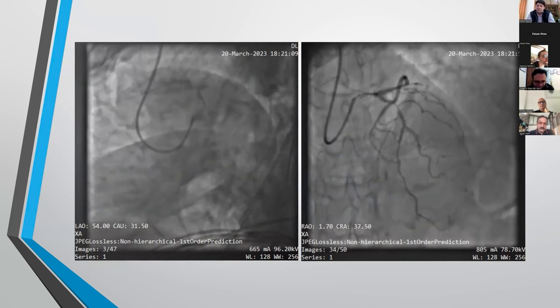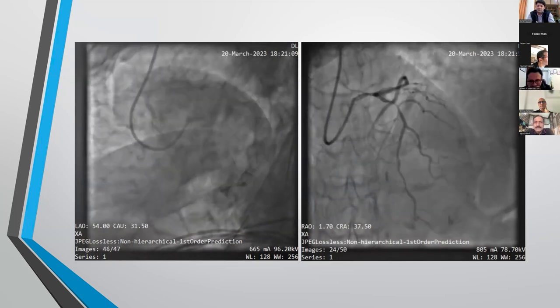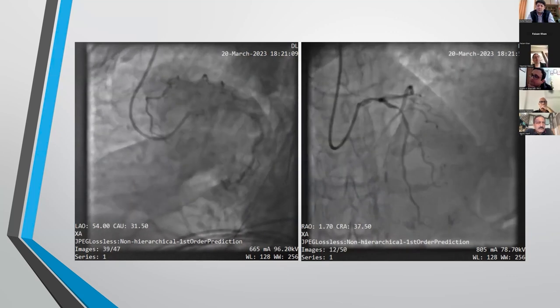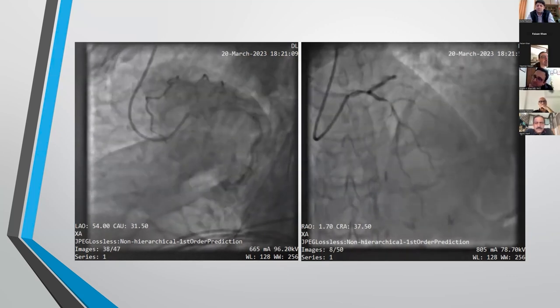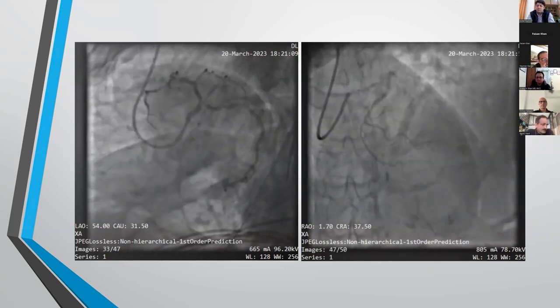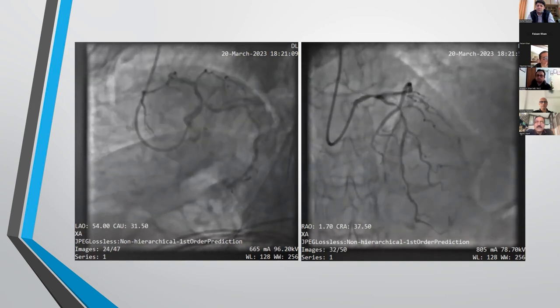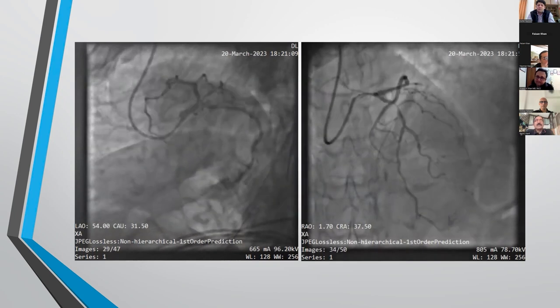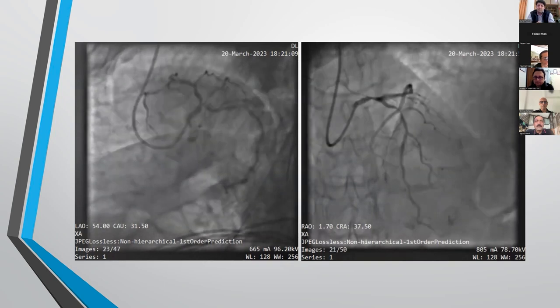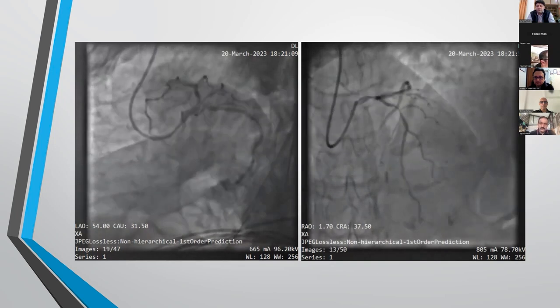It's very educative. The only point I'd like to add here is that for left main stem, we can do an FFR and then we can talk about the significance of, let's say, circumflex ostium and all. But in left main, probably FFR would not answer the question completely, because what's going to happen to the circumflex after the stent inflation? That aspect has to be covered also while we're deciding about this strategy. Left main is a situation where you can't really come back to it often enough. Left main is something where you want to give it one finality and complete it.